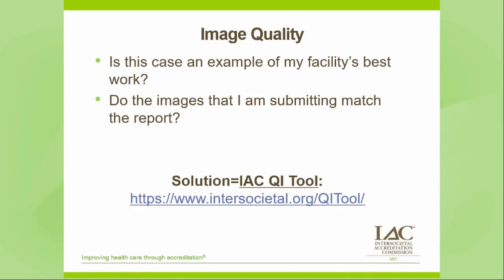First off, since you have the opportunity to handpick the case studies, here's your chance to show off your facility's best work to IAC. To do so, carefully look at the images from that case study that you're thinking about submitting and determine if it's one of the best examples of your facility's imaging with that particular body part. If it's not, you can pick another case.